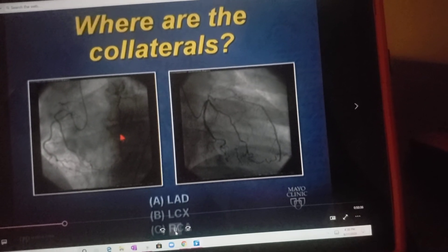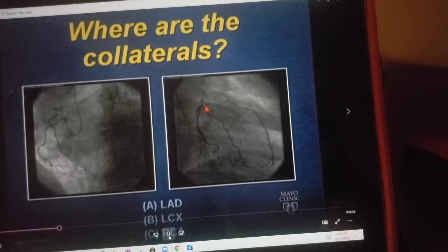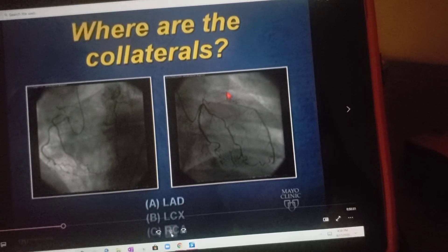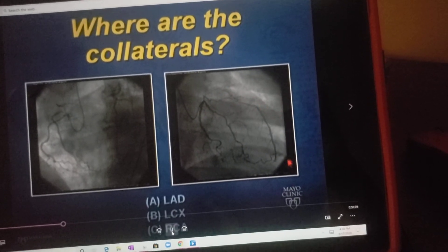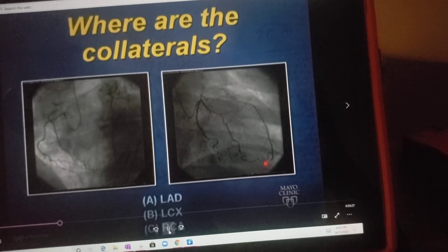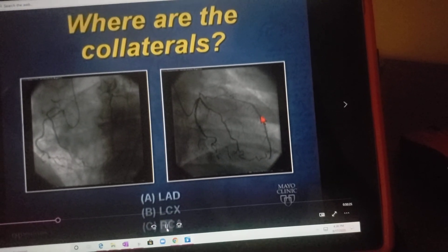This is an L.A.O. view, and here in the R.A.O. view — same concept. This is the anterior surface, this is the apex. So these collaterals are coming over and supplying the L.A.D.